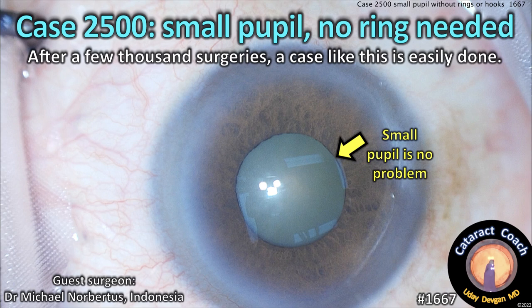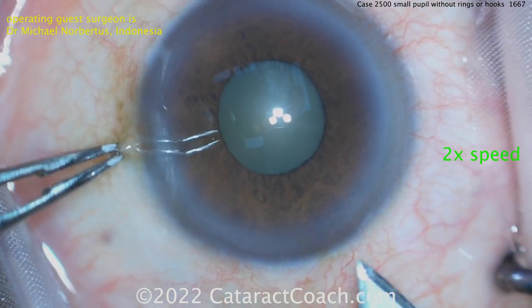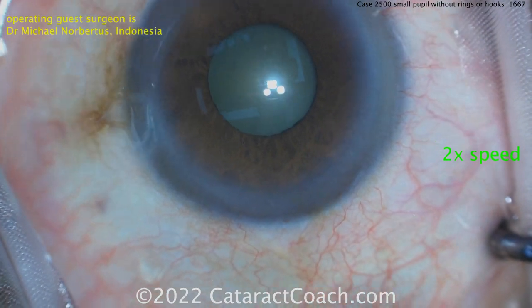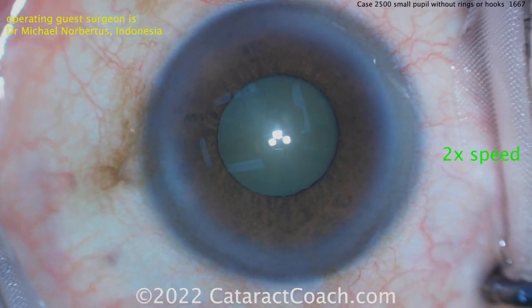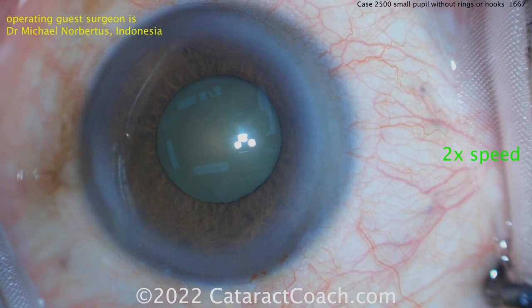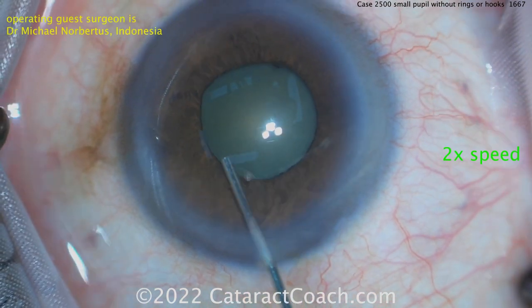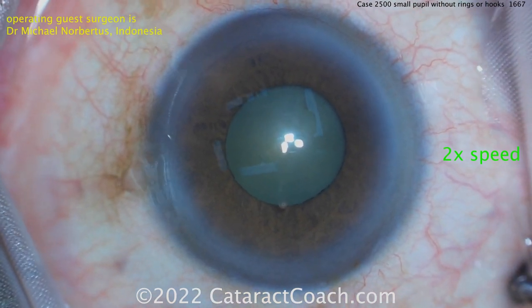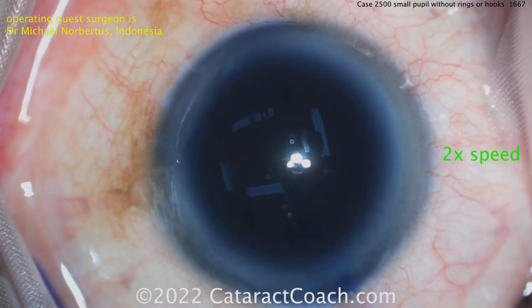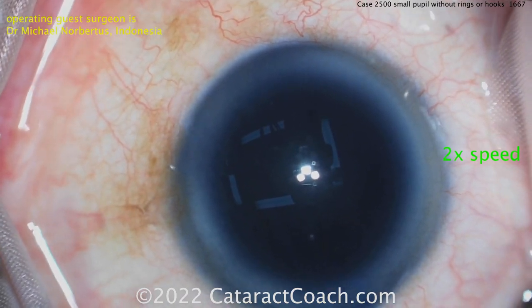cataractcoach.com case 2500 - small pupil, no ring needed. After a few thousand surgeries, a case like this is pretty easily done. We have a fantastic guest surgeon here who's going to do this case without using any pupil expansion rings, iris hooks, nothing. If you're a resident or young surgeon watching this and you've done less than a thousand cases, do not worry - be patient, learn from every case, and you'll do great.